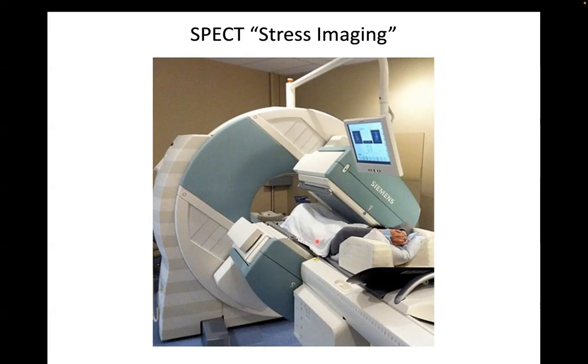There will be a slight magnification difference from one side of the body to the other, but you're doubling your efficiency just by putting a detector on the other side of the patient, right? Again, you can rotate this whole thing continuously, or you can stop it and collect, stop it and collect, stop it and collect.